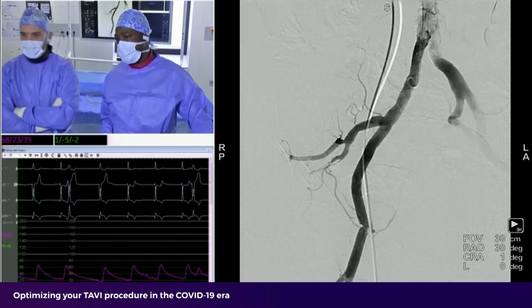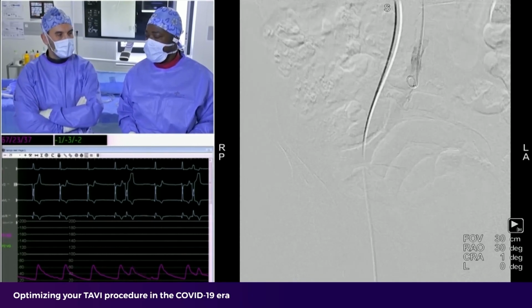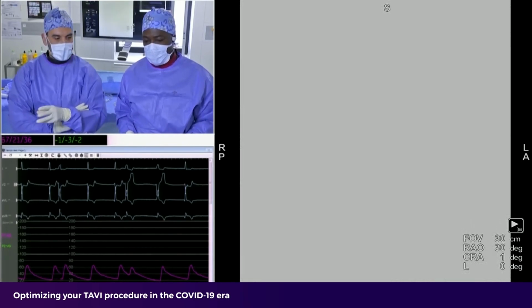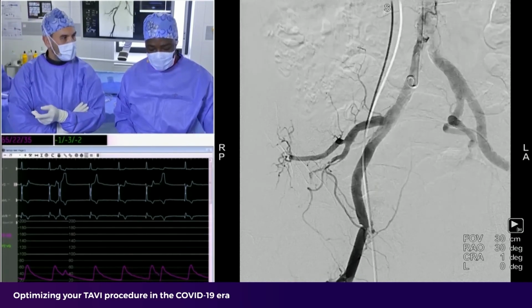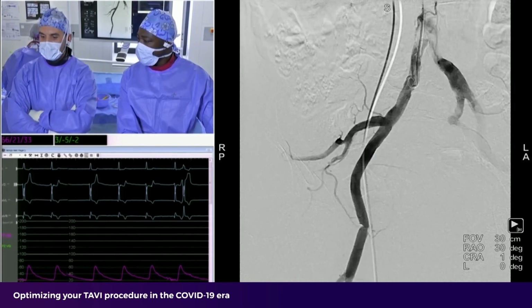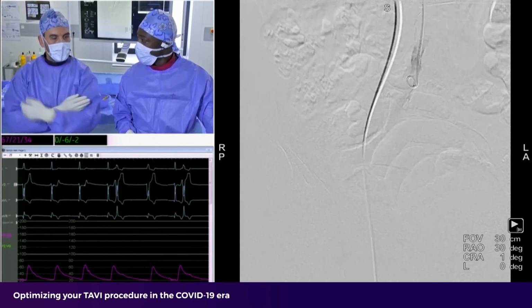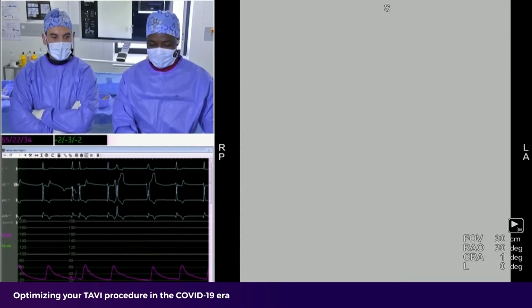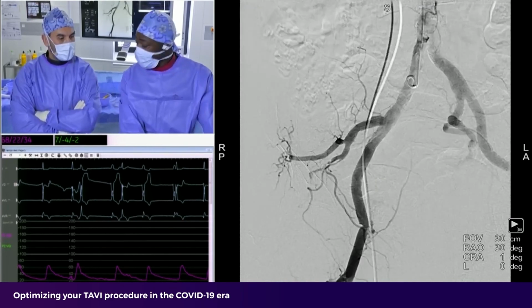Yeah. So we saw a small, thin, frail patient with heavily calcified anatomy, allowing us to highlight the specific features of a Portico device. So predilatation in that case, very accurate, safe deployment of the device because of the intra-annular feature of a valve mounted in that frame. Possibility to implant this valve really high. Good final outcome regarding the leak.